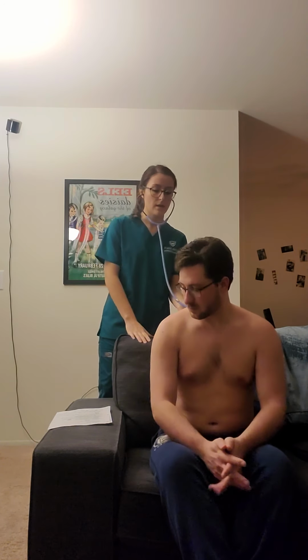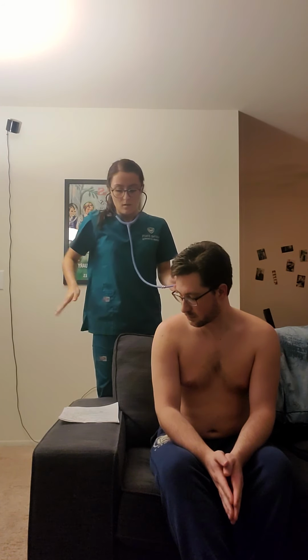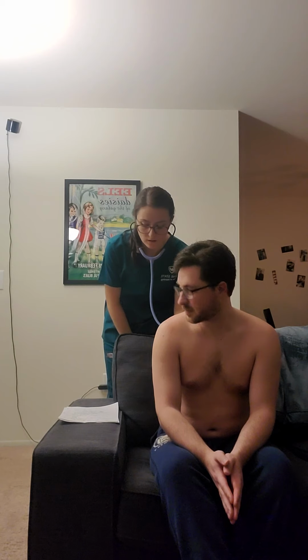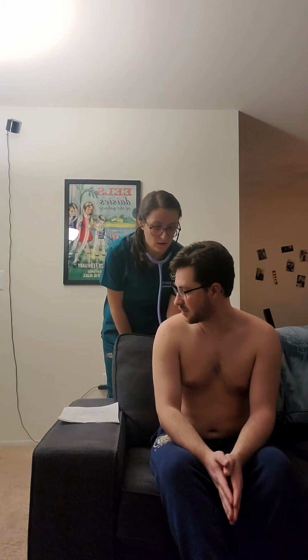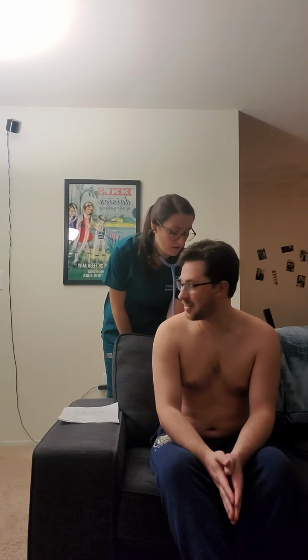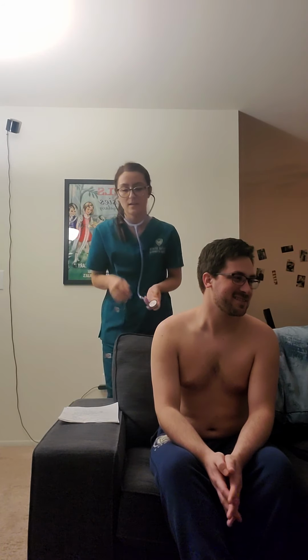So again, I'm going to take my stethoscope and lean forward a little. Okay, and then I am going to go ahead and have you say E, and I'm going to go ahead and do that where it suggests consolidation, or there might be possible consolidation. So can you say E? E. Again? E. Okay, and then if he had egophony, then the E sound would turn into an A sound.